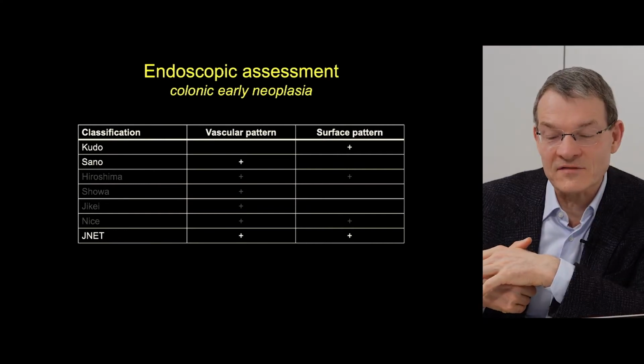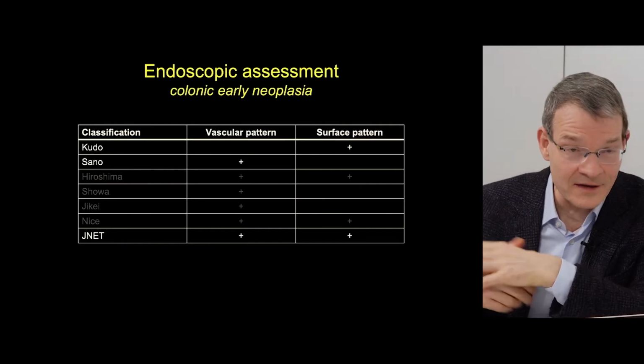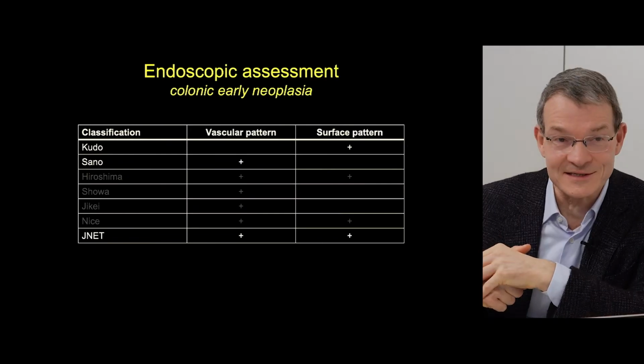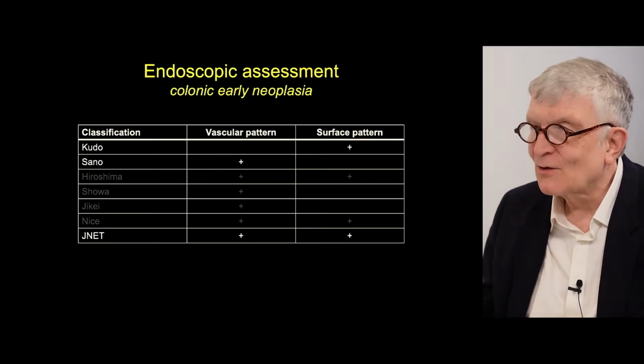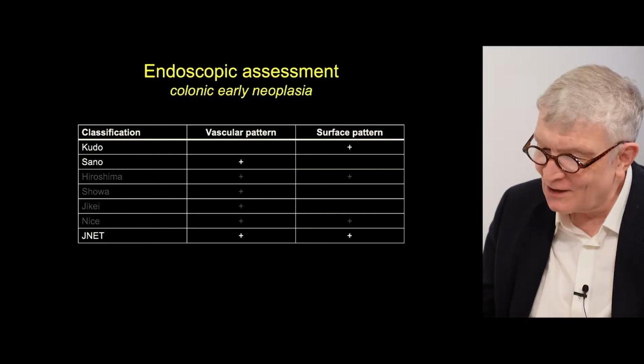Okay. And that's why I think when we propose now to use JNET classification, we also have to prepare for the assessment of the surface pattern. And the good old Kudo. Yes, this is a very important point. If it gets too complicated, we usually ask for AI, so maybe in the future somebody else will do the job. Maybe, yes. But you will convince me now.